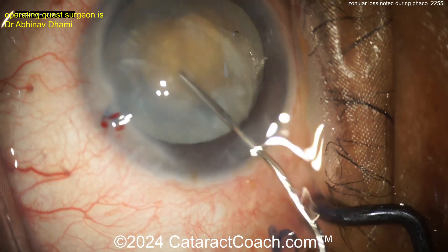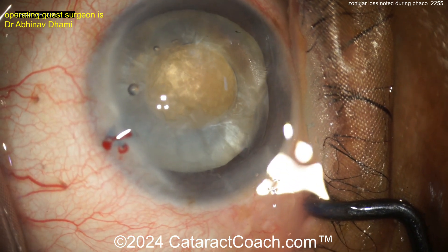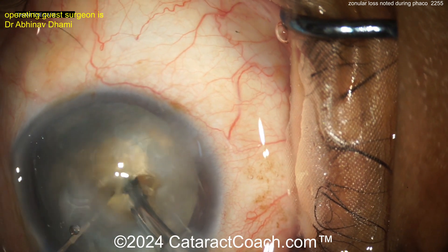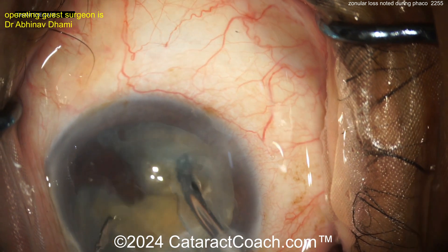The rhexis can be easy, but then even afterwards you start doing FACO and — whoa. After you take the lens material out of the bag, now the bag collapses. Getting out that liquefied lens cortex, more viscoelastic going in. Let's see a nice chop technique here. Obviously a very experienced surgeon. Nice chop down the middle, further chopping here.